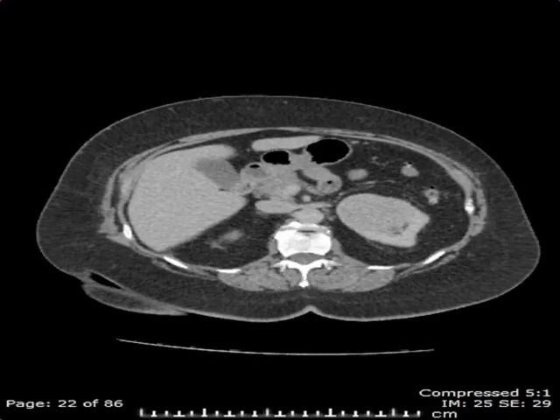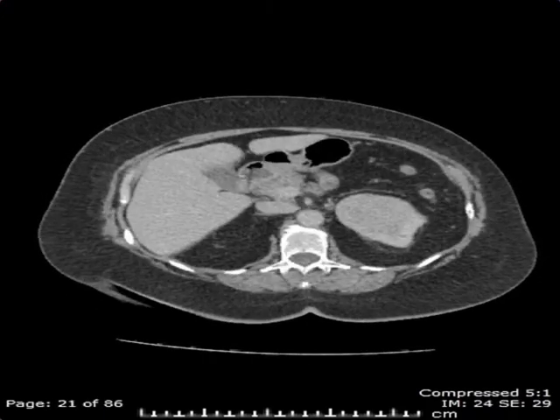On these images, we can observe some of the vasculature associated with the kidneys. On this image, this is the aorta and this is the IVC.